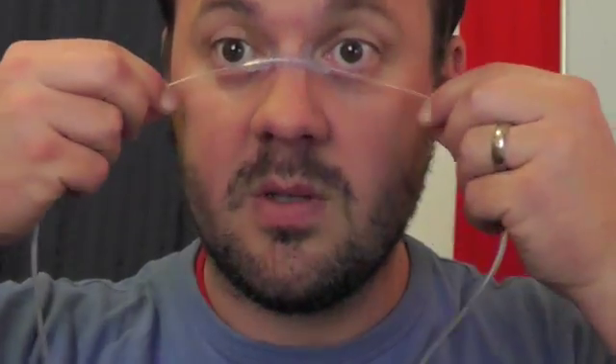And your patient will be lying there quite comfortably with their nasal prongs across the bridge of their nose, like this. So it's a really simple technique. I've got to say thanks again to Andy Chapman for showing it to me. You can improvise with the connectors. If you can find other things that can make these connect, then go ahead and use them. And if you know any, email me at andy@edexam.com.au and let me know.